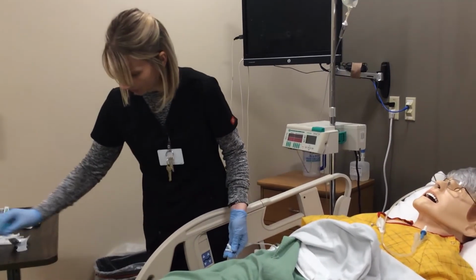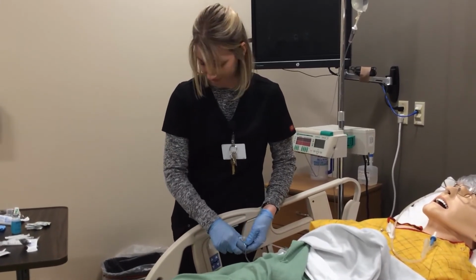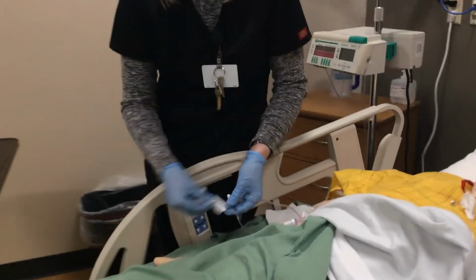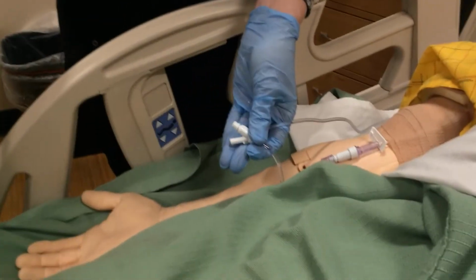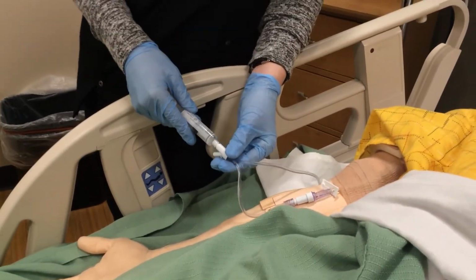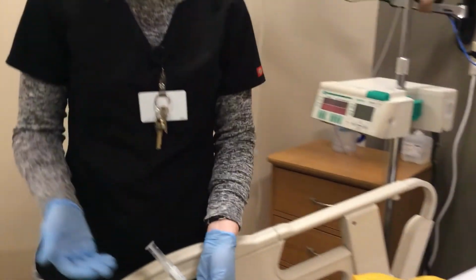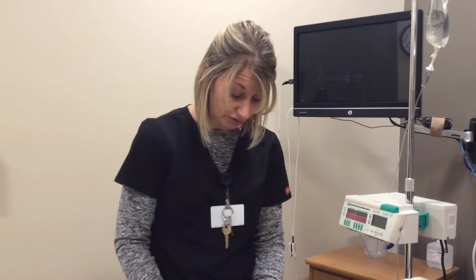Now, next what I'm going to do is I still need to do the back end buffer. Okay. Grab my alcohol swab again. Go ahead and clean off my port. Now what's very important with this back end buffer is that I push this at the very same rate that my medication was supposed to be pushed at. I shouldn't say ordered, the order won't tell you that, but what you looked up and how it's supposed to be pushed.